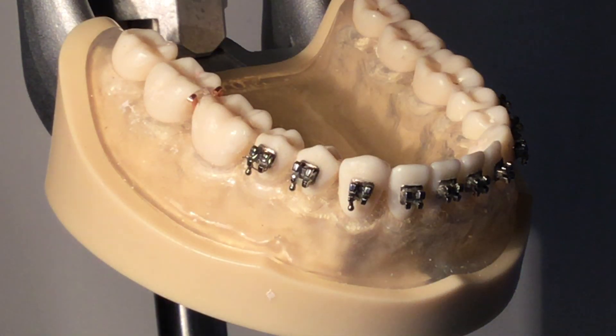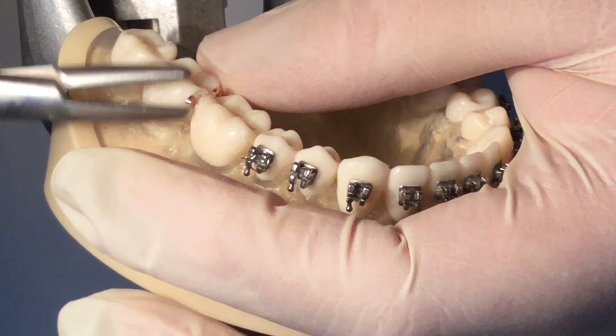With the hemostats, pull the brass wire out of the contact area.